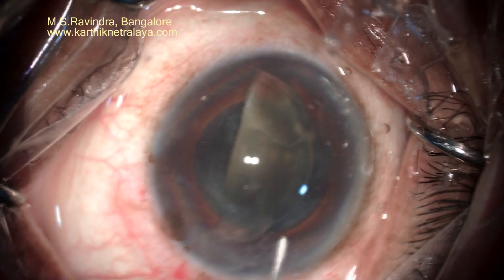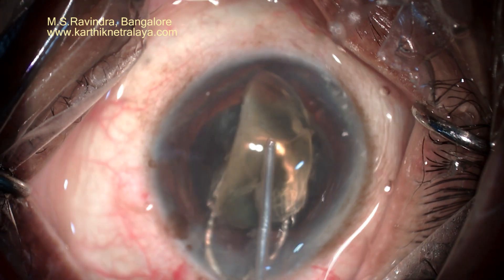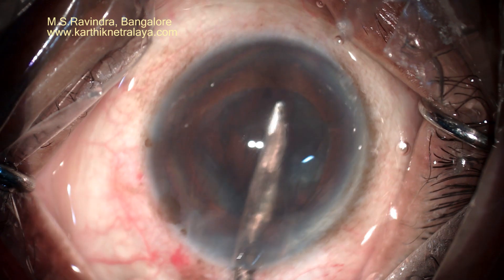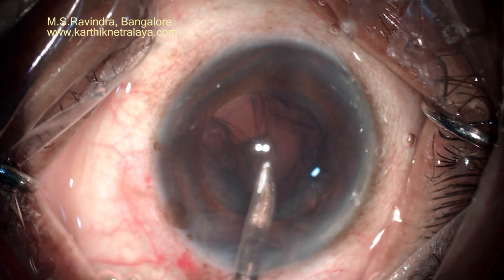I support the hemi-nucleus with a microvectis and inject visco, pressurize the chamber, and draw the nuclear piece out. This is safest to the endothelium.